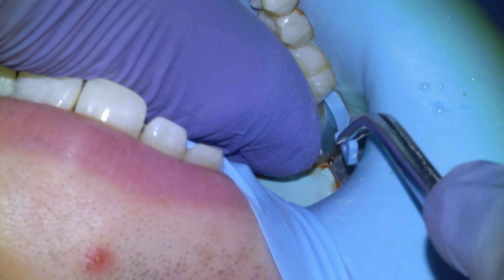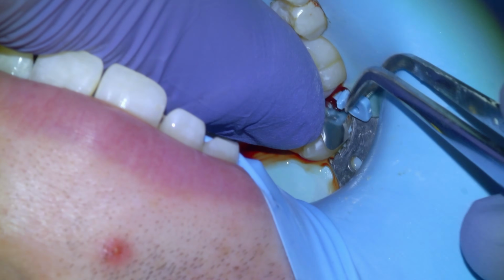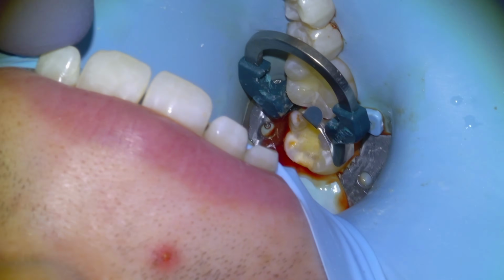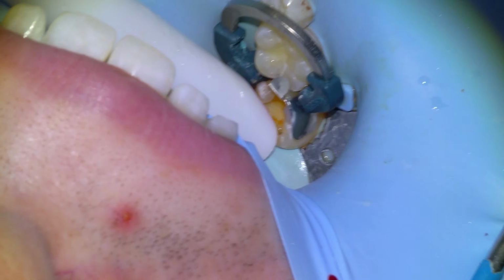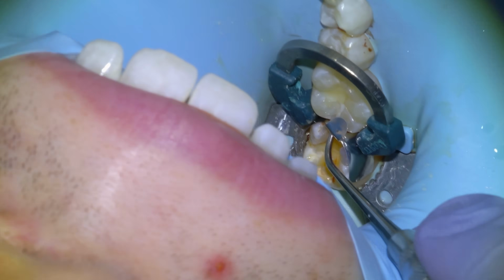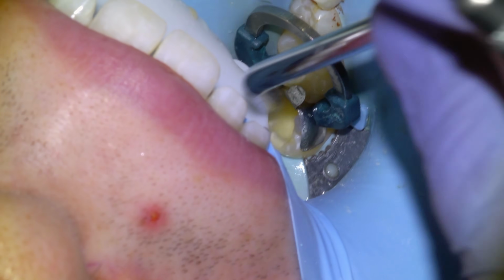Going to put on a sectional matrix. I always like to take my wedge and put it in and out while applying apical pressure to the sectional matrix because it seats fully. And then we're going to put the separator ring on, and I'll always seat it as apically as possible and then give it a shake to force the ligament apart. And then going to burnish our band against the proximal tooth, and then we're going to be ready to etch.